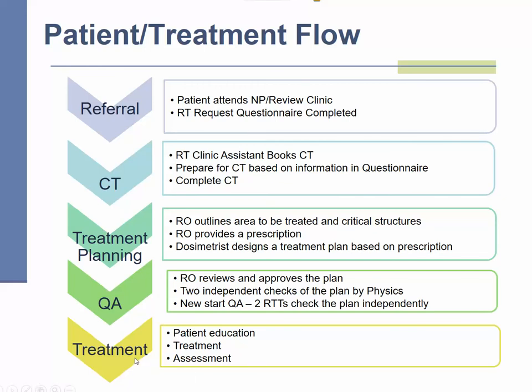They will arrive for their treatment. We typically provide a small patient education session in order to explain what the daily routine of radiation therapy looks like. We will give them their treatment, and while they're on treatment, it might be a single fraction or up to many weeks. We will continue to monitor and assess how they're doing with side effects and make any necessary referrals as needed.